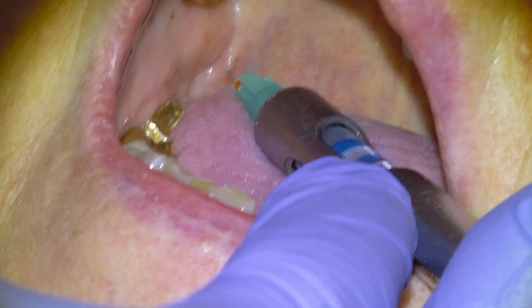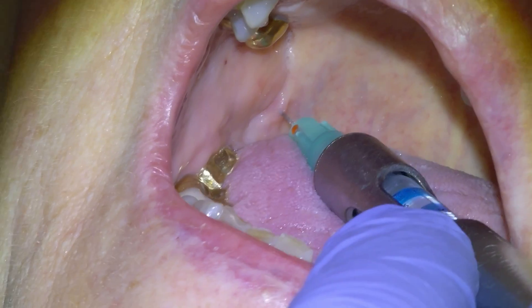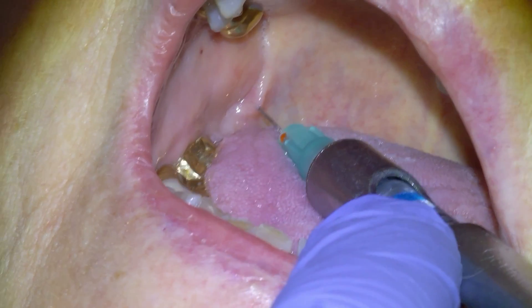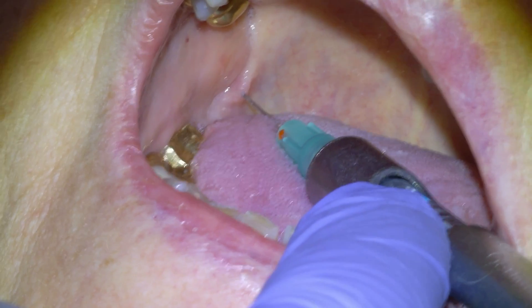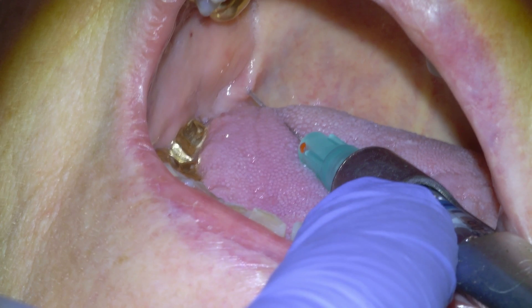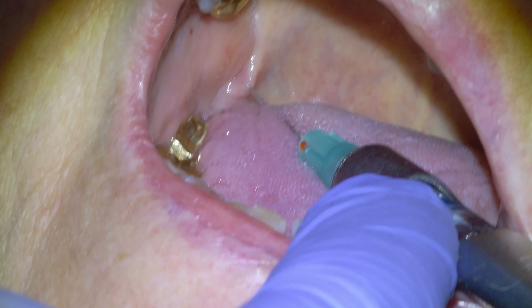Once we've done that, we're going to start retracting. Let them know that as we're retracting, they're going to feel a pinch right around here as it enters new tissue. And then that's the mandibular block. We're going to give a long buccal as well for this procedure. One of the biggest things — let the patient know they need to feel a numb lip and chin from the block, and that's going to be our indicator about whether we hit or not.